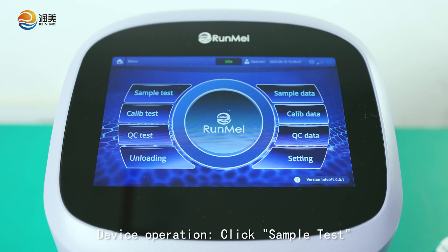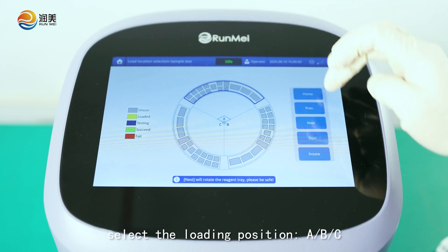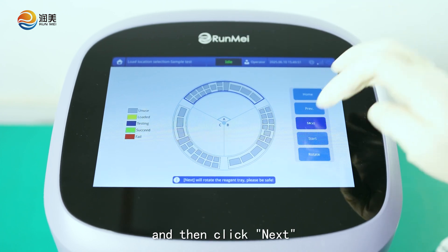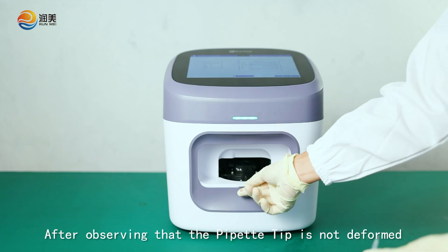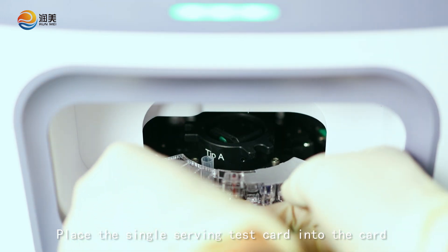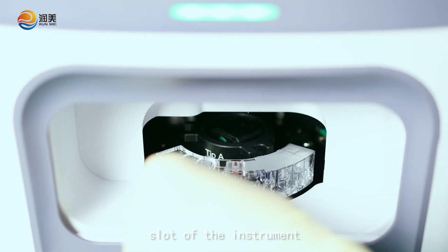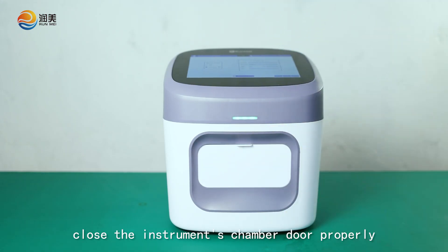Device operation: click Sample Test, select the loading position, and then click Next. After observing that the pipette tip is not deformed, insert it into the pipette tip hole. Place the single-serving test card into the card slot of the instrument and then close the instrument's chamber door properly.